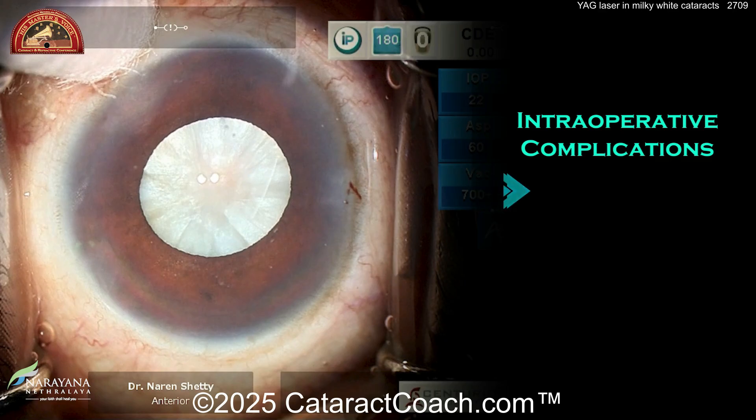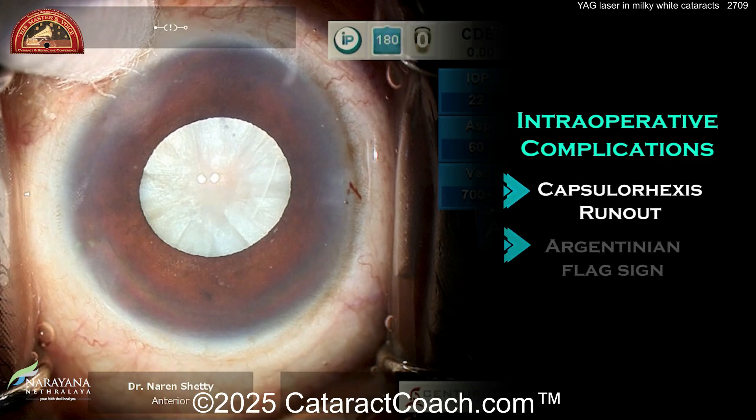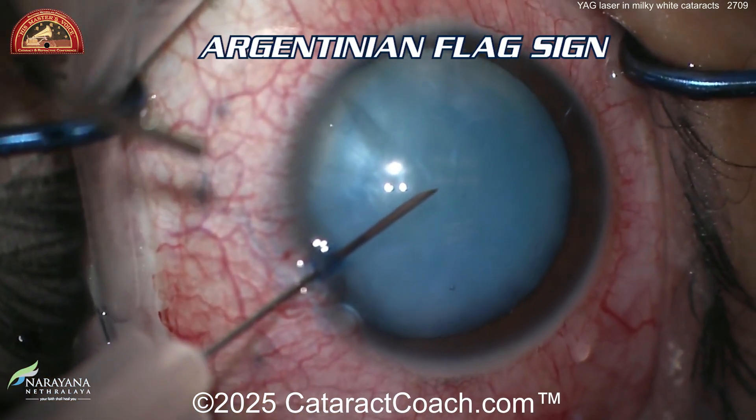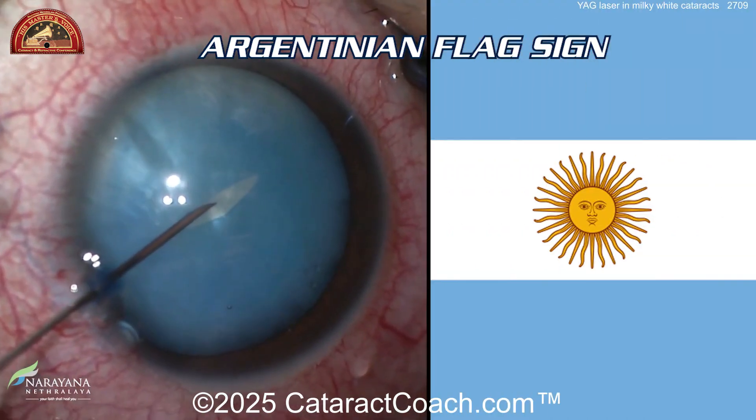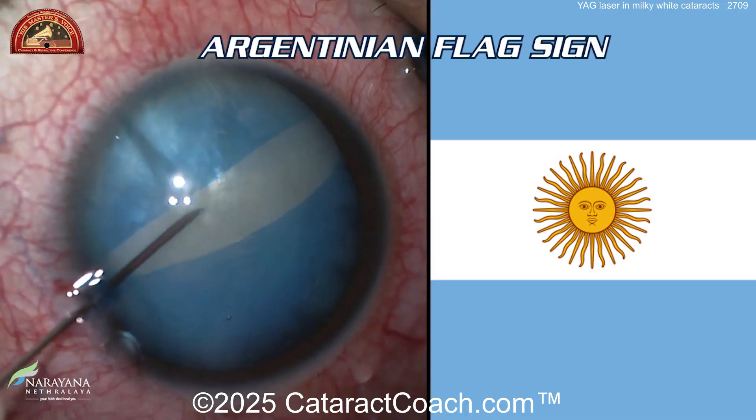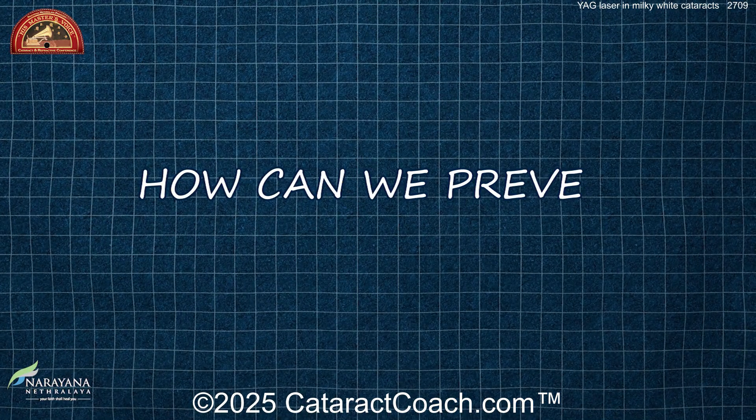So what are the complications here? You can get the dreaded capsule runout — what's called the Argentinian flag sign — where the capsule splits wide open. Here's an example: you go in there with an intumescent lens and a pressurized bag, you poke it, and the lens capsule splits open. It looks like an Argentinian flag. It's not what you want to see.